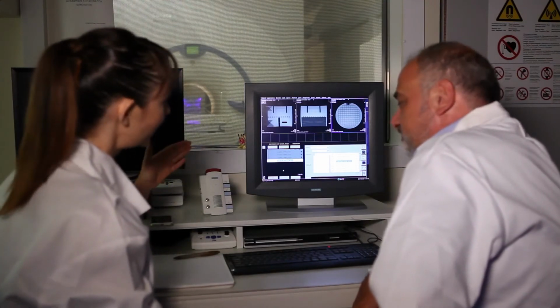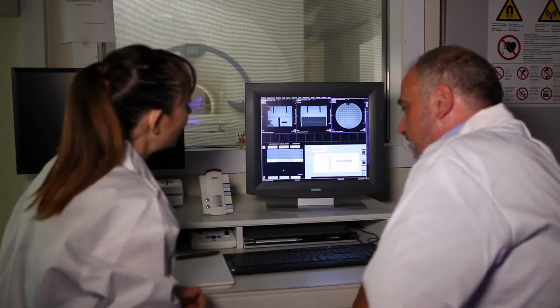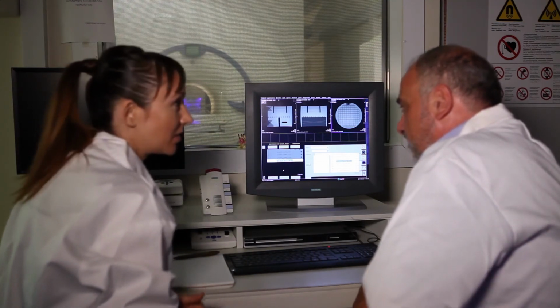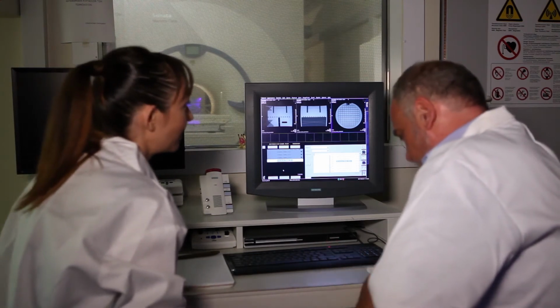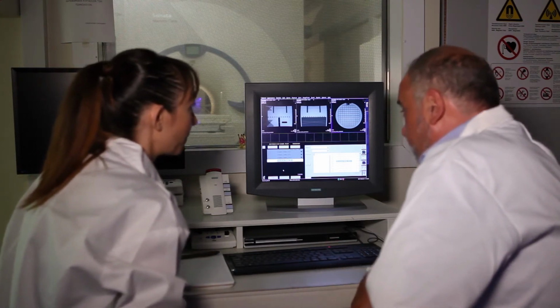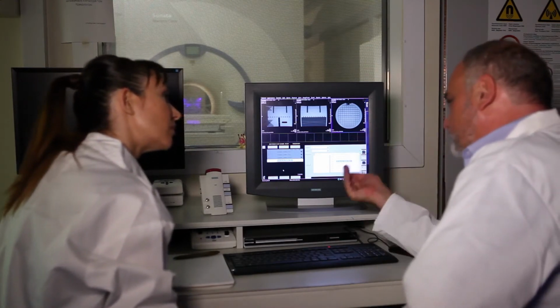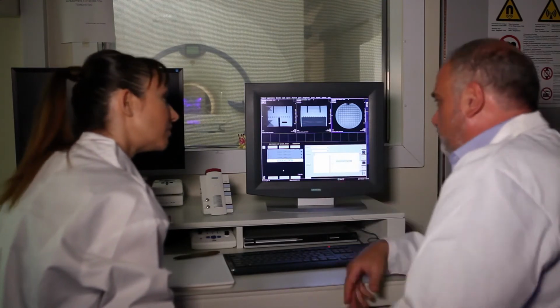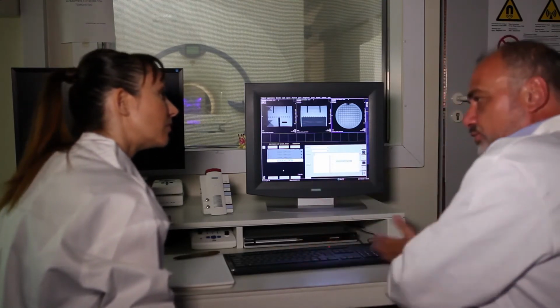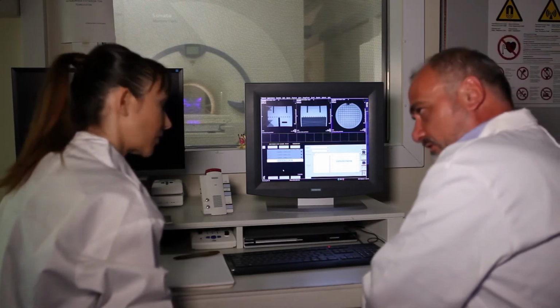Every different slice is for a specific test. Exactly. So that's why we need to position them where the manual explains to do so. You have to position them at the specific points, and you actually obtain images which are going to be used for a specific test in the post-processing mode, in order to measure a whole bunch of quality control tests that you have to do in order to say that this machine works okay.